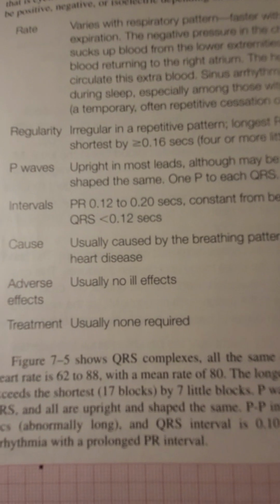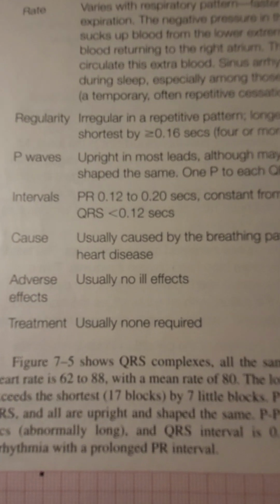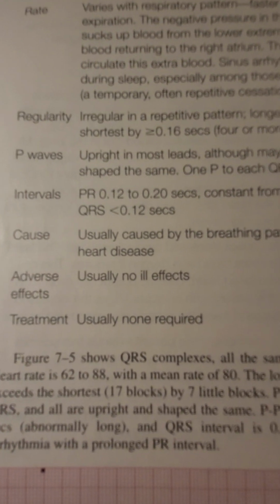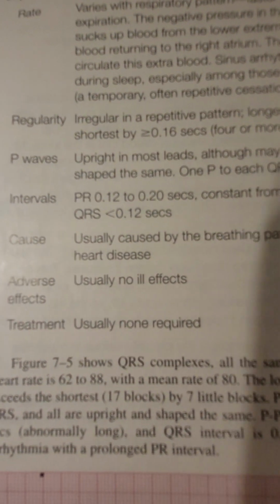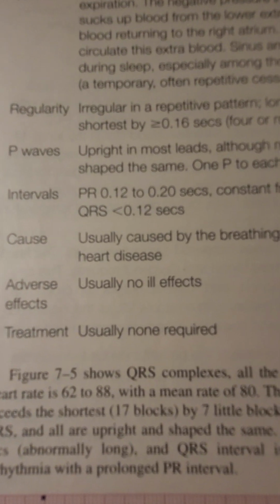And there's a saying, but I don't remember how it goes. Something about the P wave and the QRS being married, but then if they start separating, I don't know. I'll look into that later, and I'll tell you what that means. But when it's a normal rhythm, the P wave should be married or always close with the QRS.